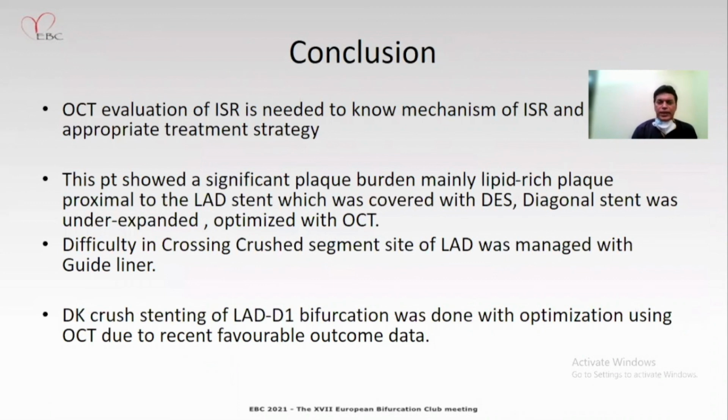Diagonal stent was under expanded, which was expanded well with the re-DES and optimized with the OCT. Difficulty in crossing the crushed segment site of LAD was managed with the guide liner with balloon tracking. DK crush stenting of LAD-D1 bifurcation was done with the optimization using OCT due to recent favorable outcome data.